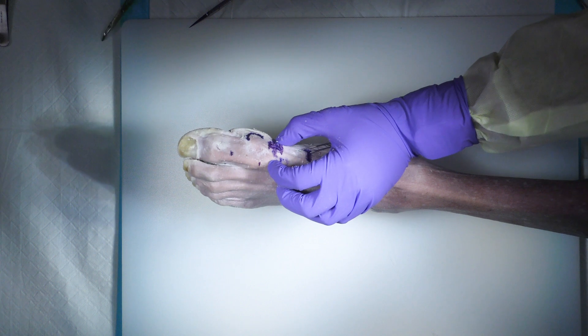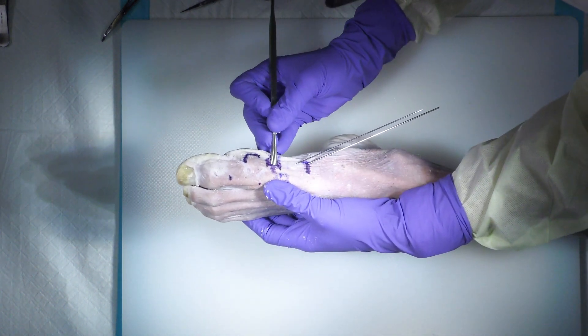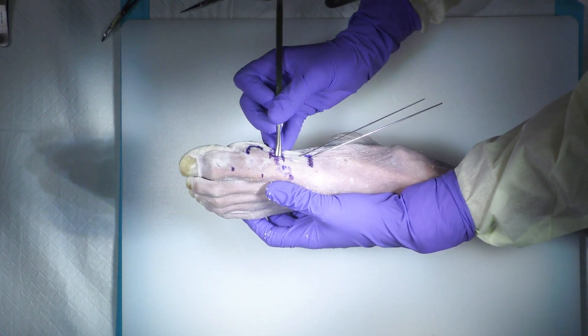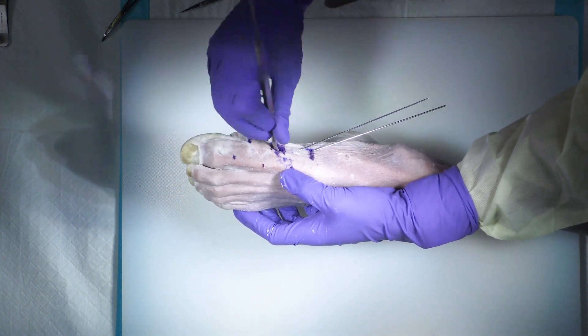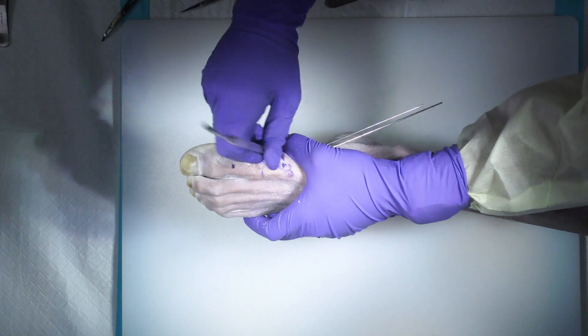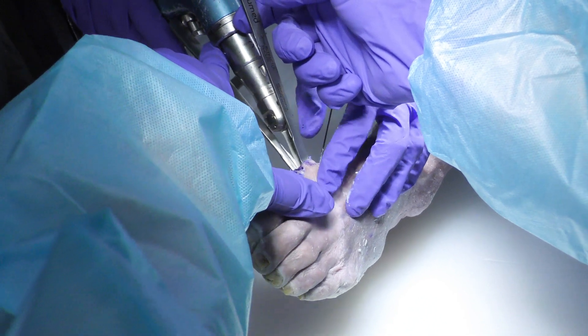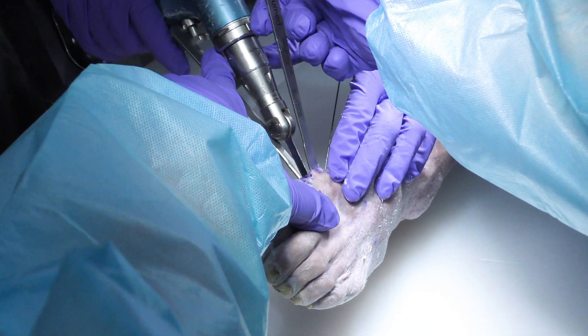Then I'll make a deep bone incision. Next I'll take a freer and essentially try to lift up the periosteum and all of these structures in one swoop, making sure I'm staying underneath the EHL tendon and staying right in line with my planned osteotomy landmark. Then I'll do the same thing plantarly, trying to stay nice and inside that periosteum. Now I'm completely free dorsally and plantarly — the freer moves really nicely. Someone holds to give me my clear space so I know I'm protecting that EHL tendon dorsally, and then I sneak in and start to make my cut.